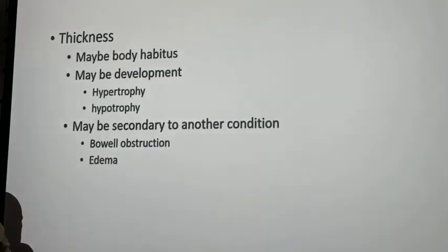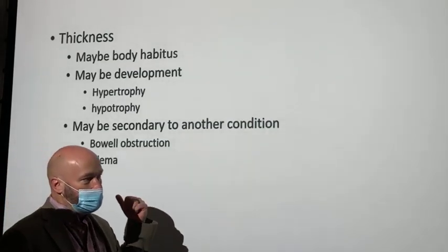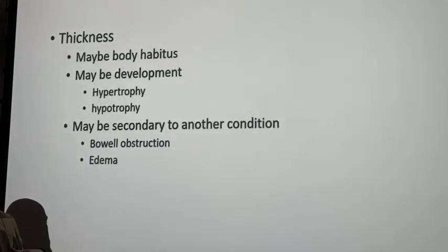And to take it a little bit further, we get a lot of stat portable chest x-rays. You know, the patient sneezes and we get a stat portable chest x-ray, right? Sometimes those stat x-rays are for central line placement, okay? So what's the danger in a central line placement? It could go into the lung.